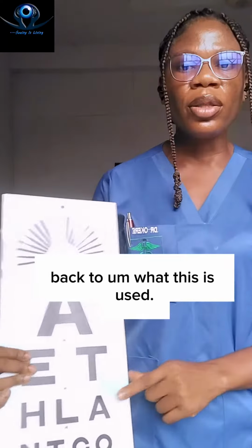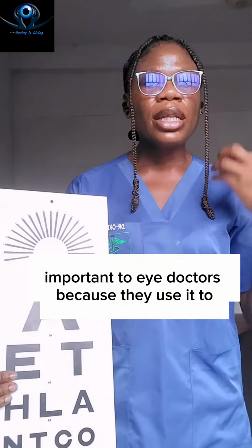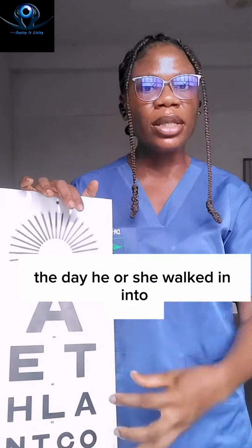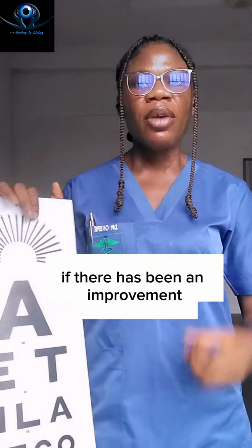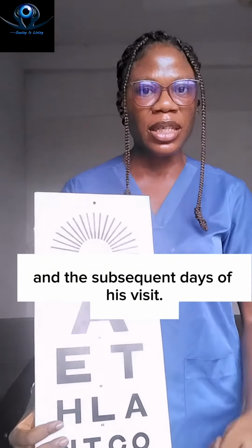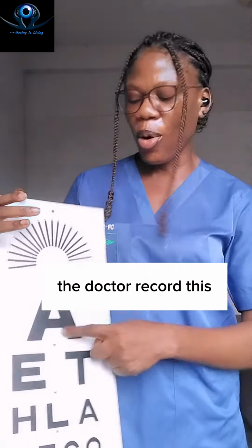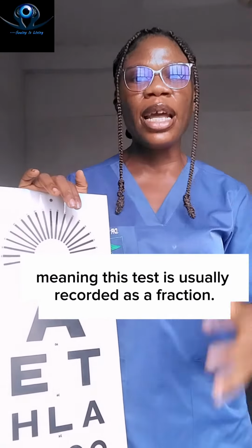Back to what this is used for. This chart is very important to eye doctors because they use it to determine how well a patient can see the day he or she walked into the eye care department, and subsequently it is also used to track if there has been an improvement between the first day he or she visited and the subsequent days of the visit. Let's say the first day you visited, what you were able to read or see is this A. The doctor will record this as 6/60, meaning that this test is usually recorded as a fraction.